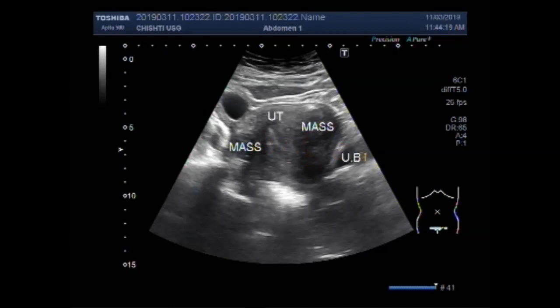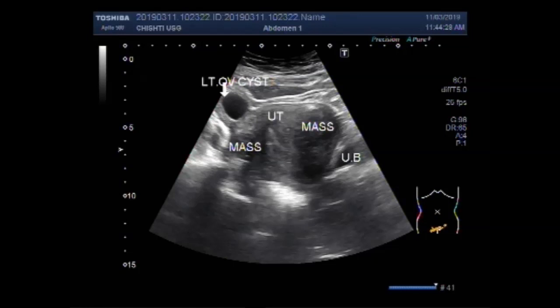This is the urinary bladder, and this one is the left ovarian cyst. The cyst is round to oval in shape, having a clear fluid in its interior.